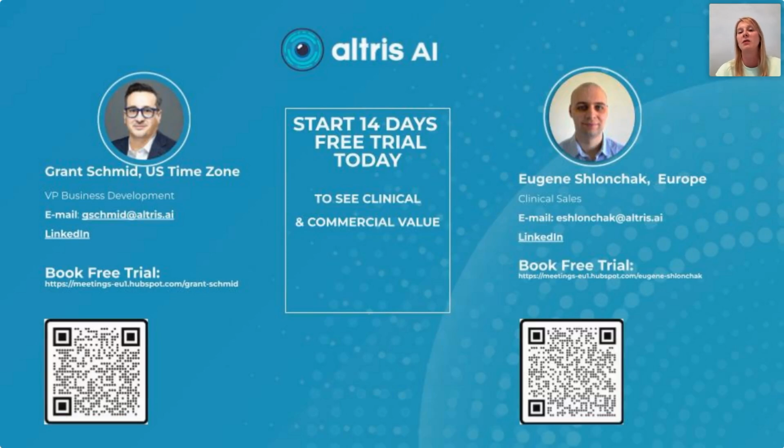So basically, depending on where you're located, we have servers in the United States, in the European Union, in the Middle East, in different countries. We are completely GDPR compliant, and you can be sure that the data will be safe.